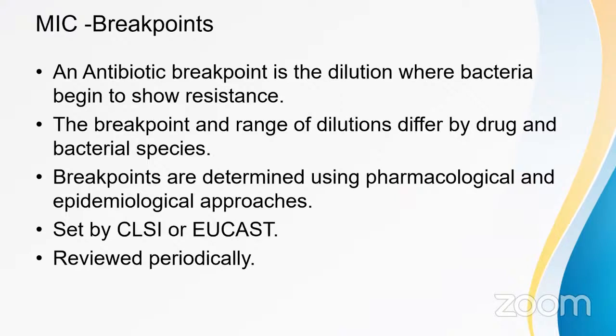So what are MIC breakpoints? An antibiotic breakpoint is the dilution at which the bacteria begin to show resistance. The breakpoint and the range of dilutions differ by drug and bacterial species. The breakpoints are determined using pharmacological and epidemiological approaches, called ECOFF, and they are set by CLSI, which is US based, and EUCAST, the European one. They are reviewed periodically.